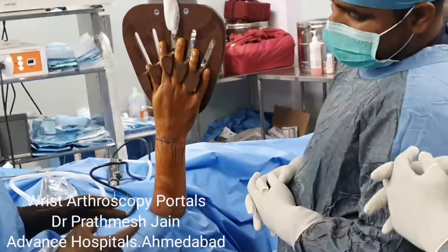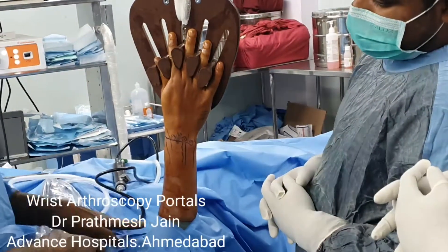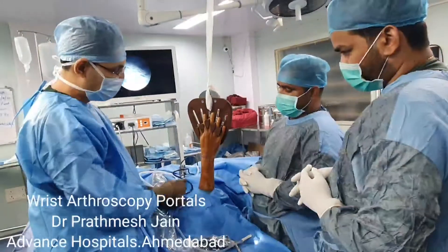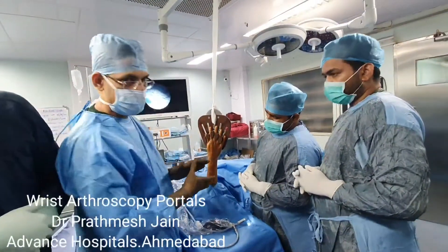If you talk about the positioning, we do it in a supine position. We keep a traction here and a counter-traction here, and we try to increase the traction so as to increase the space.